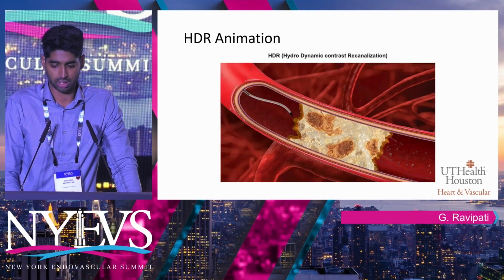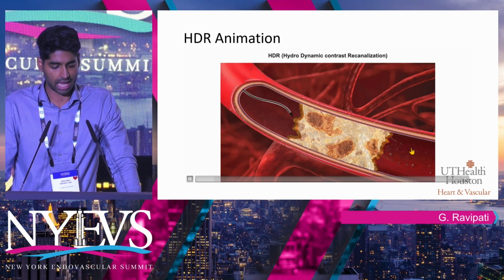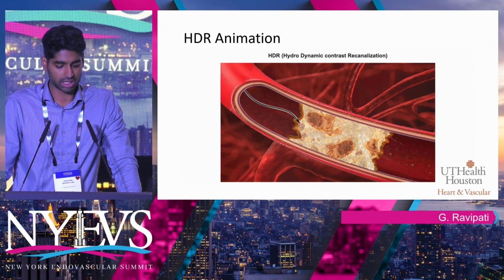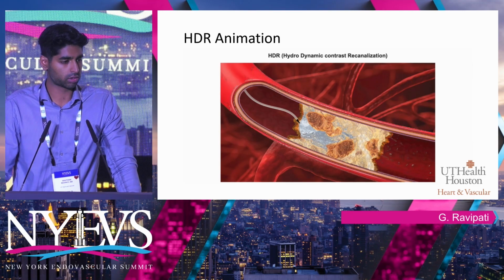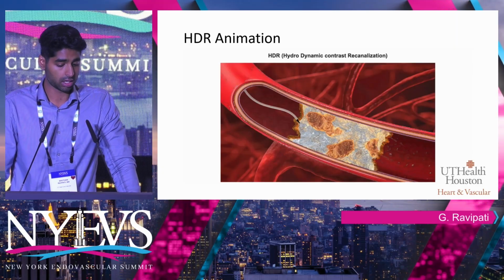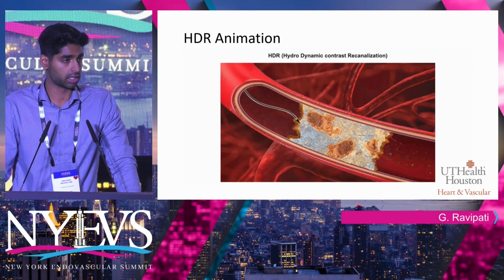And I have an animation here showing how that works, where you see the cap puncture in the proximal cap of the CTO, and then a gentle injection of a small amount of contrast. The proposed mechanism of action is that you're recruiting soft, lipid-rich areas of the CTO so that you can have a polymer-jacketed wire traverse pretty easily through the CTO.